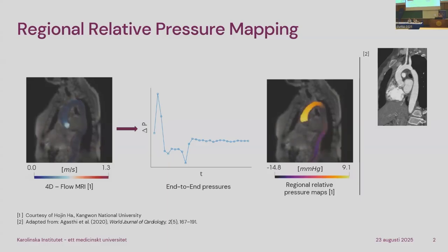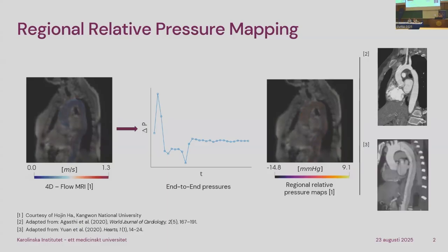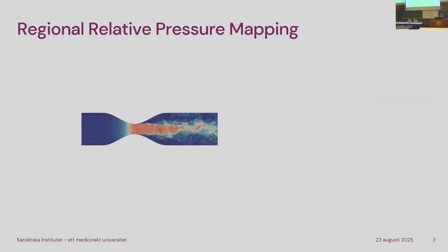So for example, this would be relevant for aortic coarctation, but you can also try to develop new biomarkers based on imaged velocities and reconstructed pressure, for example for aortic dissection. But not all flows are equivalent in complexity, and you've also heard about turbulent flow. Basically what I mean, again as a reiteration, is flow that is very hard to predict on the observable spatiotemporal scales.